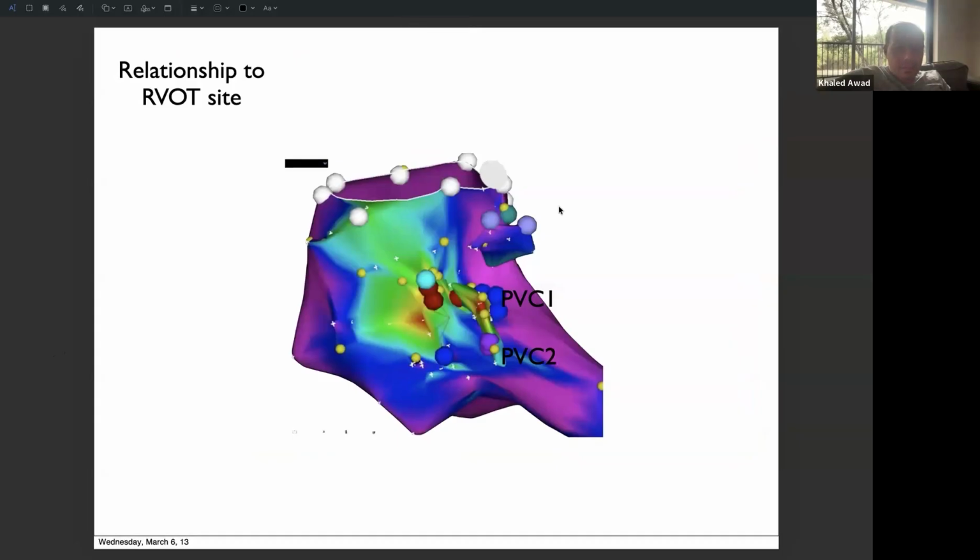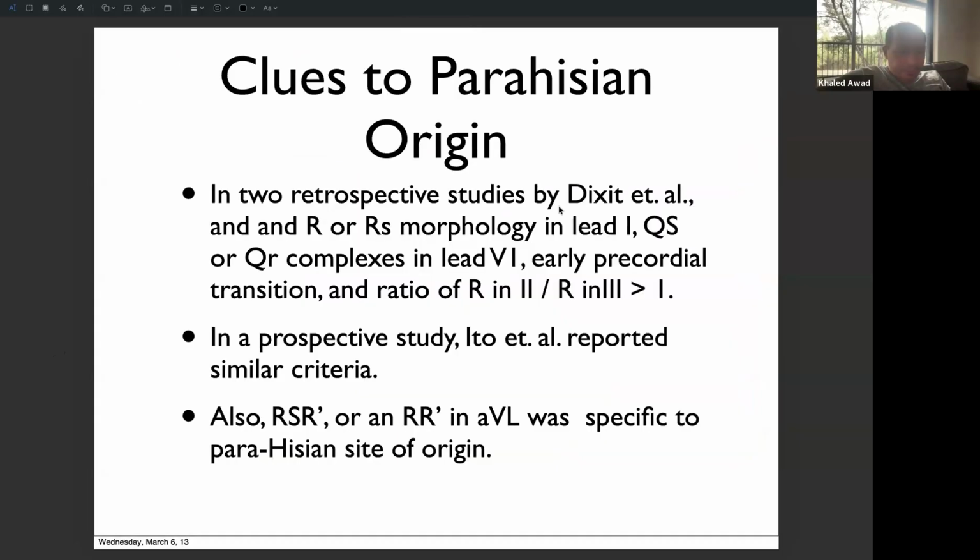Also septal VTs, and the reason septal VTs are very difficult to manage is they have access to too many structures to exit. So they can exit in the RVOT, anywhere in the RVOT. They can exit in the LVOT under any cusp, and they can exit in the bottom towards the septum, and they can exit towards the papillary, so they can exit. They're just very difficult to chase. But the exit sites map the site of origin for you, or site of where the scar is, usually in very predictable spots, just hard to ablate.